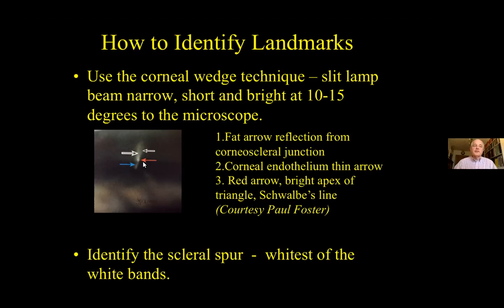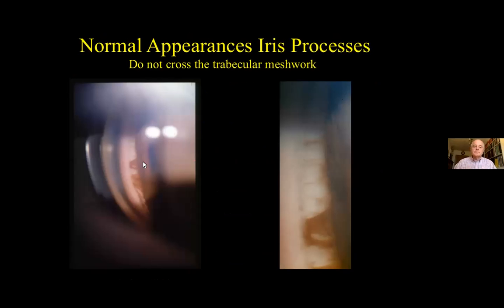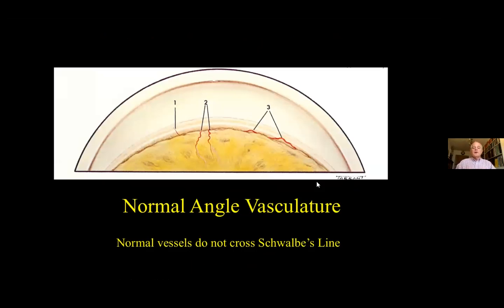Practice will allow you to become familiar with normal appearances and variants. These are iris processes — strands from the iris to the meshwork — but they don't cross the meshwork. You can see them here, some thick and some thin. Various patterns of blood vessels may also be present when you look at the angle, and these may be entirely normal. Note that normal vessels don't normally cross Schwalbe's line.